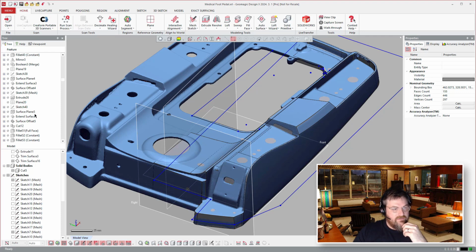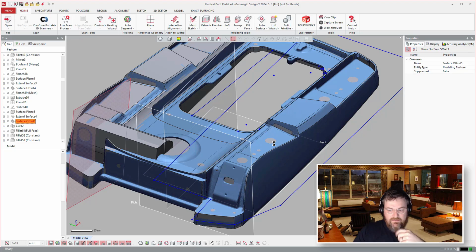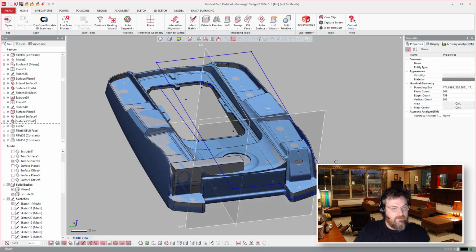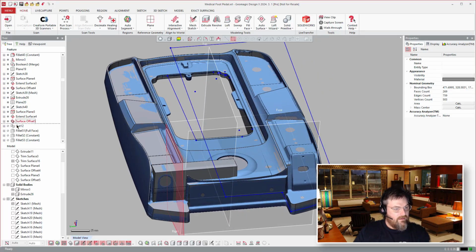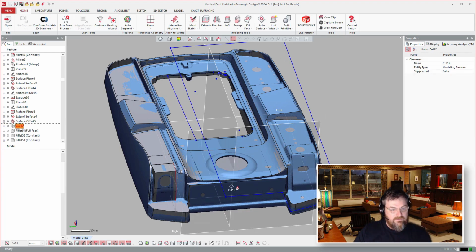Once you understand the concept of how to model this part, you're going to see it's the same steps, just cutting the pieces, mirroring, rolling back and trimming these tool entities from the main body and going from there. So you'll see here it's a lot of rinse and repeat. So we went ahead and mirrored, and then now we'll do a cut to cut that away.